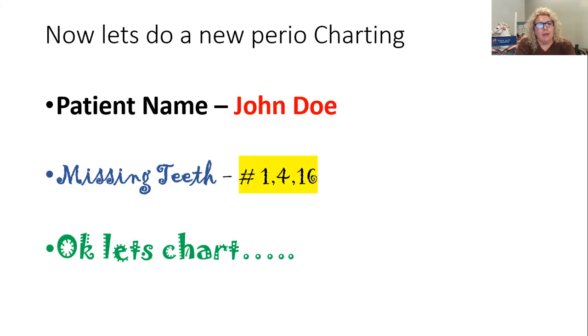Now's when your doctor or hygienist might stop and they might record bleeding. We're going to record bleeding as a red dot, and we'll go over this in class and I'll show you. On the computer screens, it's going to record it as a little blood drop, just a dot at those places, so it'll be a little bit easier on the computer. But we're just going to put a red dot beside the numbers that would have bleeding points. So they might stop now, give the patient a quick break, maybe even give them a quick rinse.